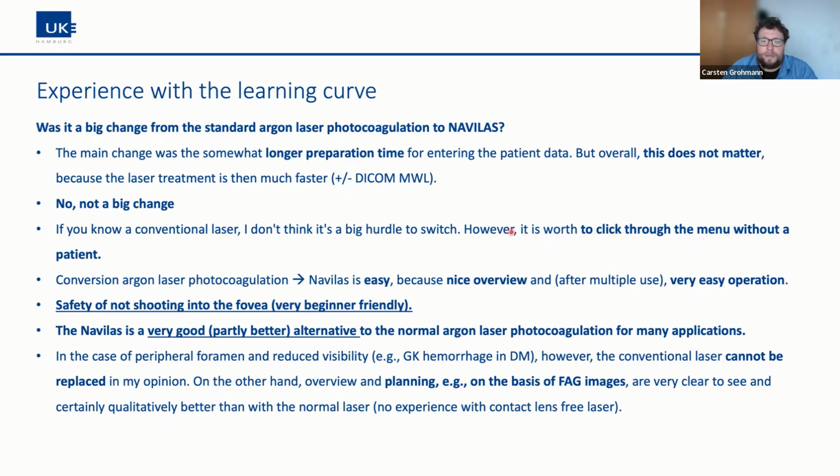However, it's worth clicking through the menu without the patient. You should get familiar with the system to know where the different options are. I think it's also very beginner friendly because you have the main options directly on your laser system with buttons, and not only in the software. Safety of not shooting into the fovea: it's very beginner friendly because you can set caution zones. It's a very good alternative to the normal argon laser for many applications.